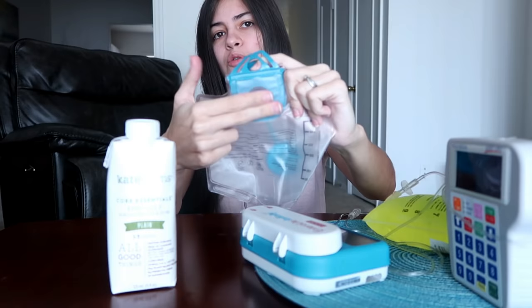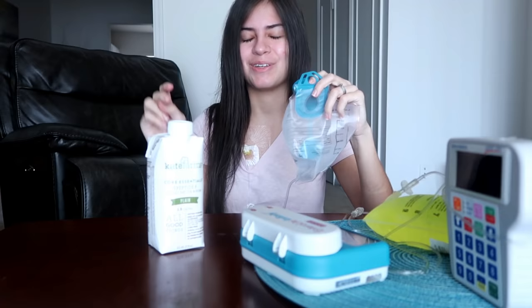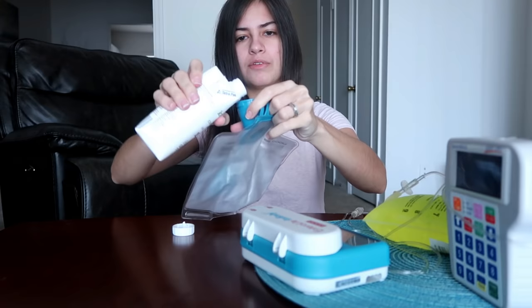And anyways, then as you see, this bag is suctioned to the opening. So if I pour the formula in here, it'll overflow. I have done that many times. I call it a rookie move. So I blow into the bag just to open it. And then I pour the formula in.